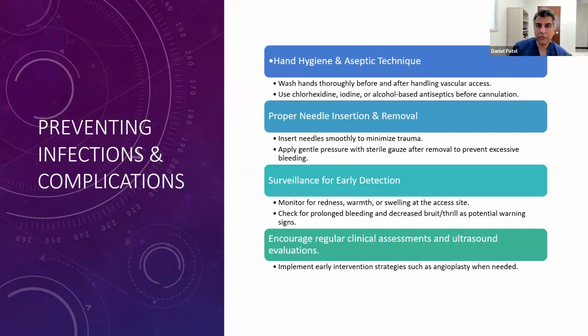Basically, infection control is really key for everything, and it's really taking the time to use the standard hygiene and aseptic techniques: washing hands, cleaning the access site, prepping it. We're poking needles into these accesses every other day. They are patients that are prone to infections, a lot of diabetics, a lot of infectious issues. So we want to keep this as sterile and clean a process as we can.